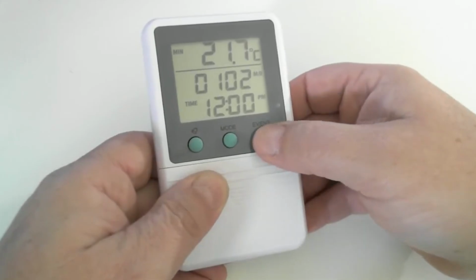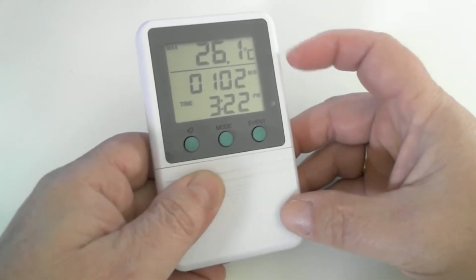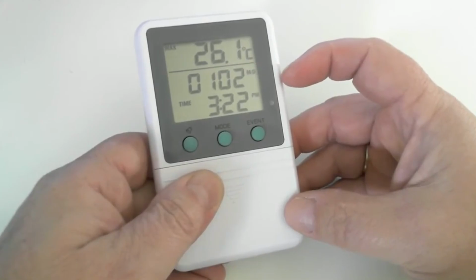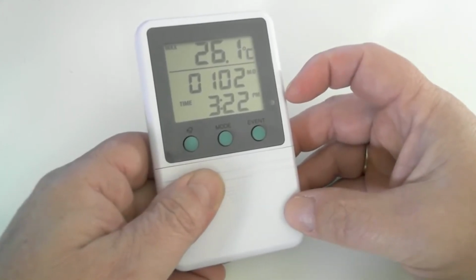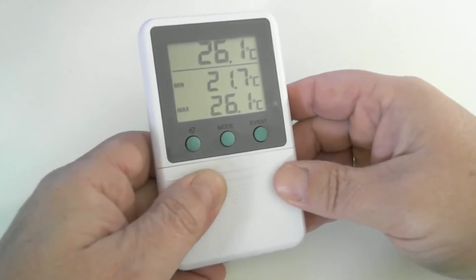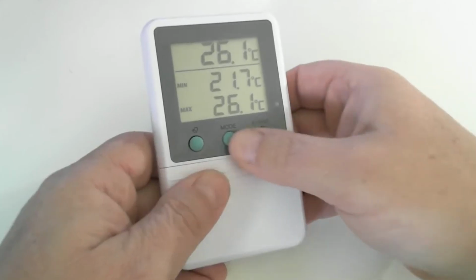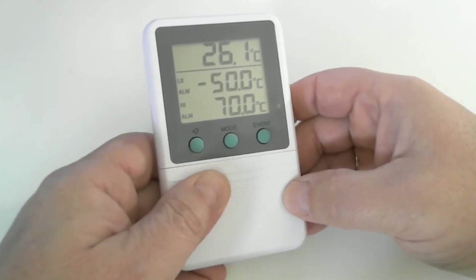Press event again, and now we see the max temperature with the month and day in the center and the time at the bottom of the screen of that occurrence. Press event again, and we are back to the main display screen. Press the mode button, and we're now in the alarm display.